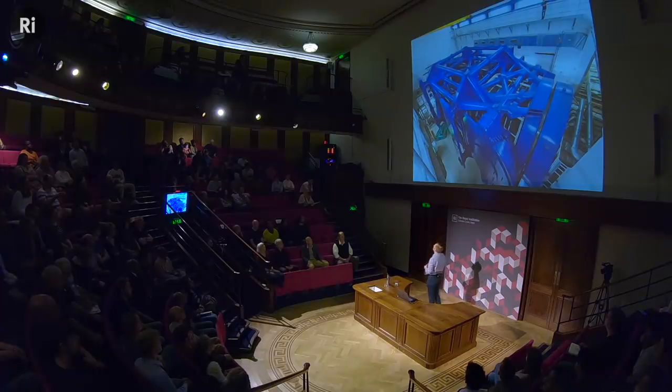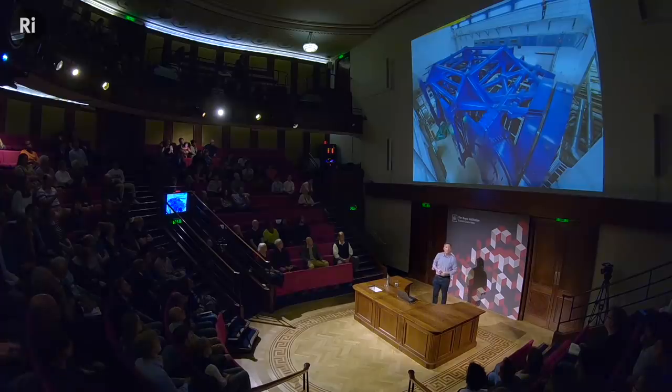22 meters long, 13 meters in diameter, so about the same length as an articulated lorry. And what's the height of this lecture theatre? What would you say, 7 meters, maybe 8? So twice the height of this lecture theatre. And that entire structure has to rotate around the patient with millimeter precision.